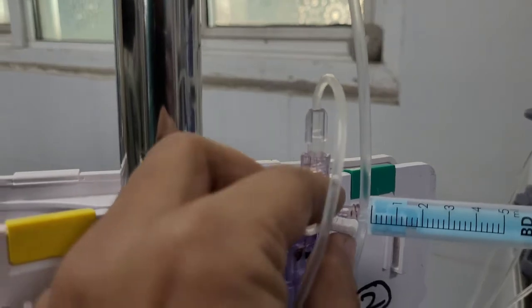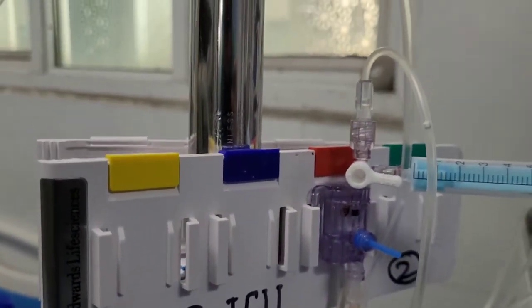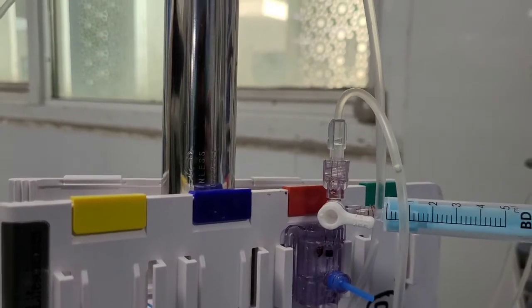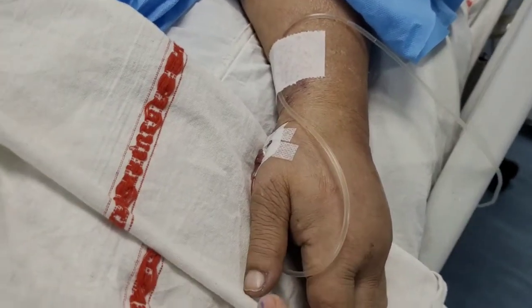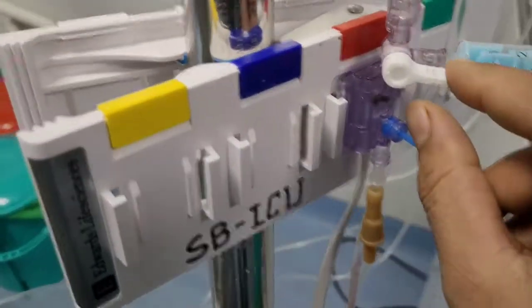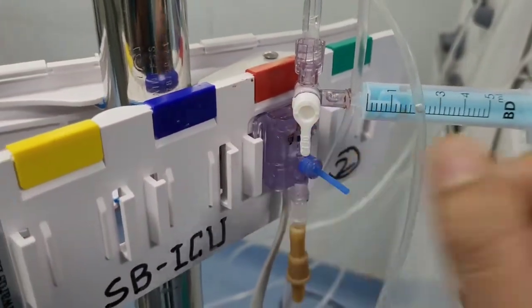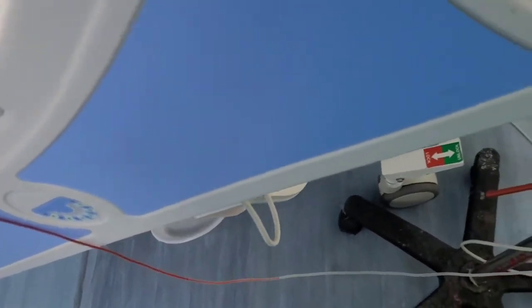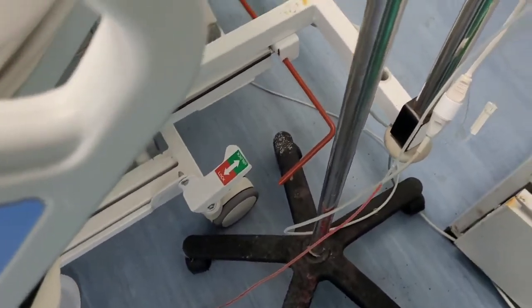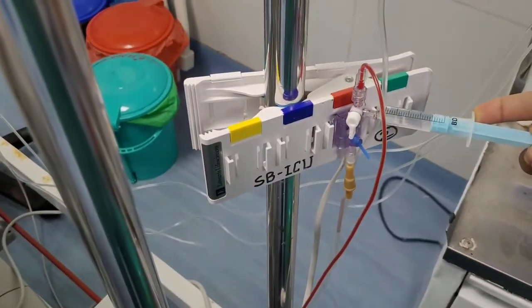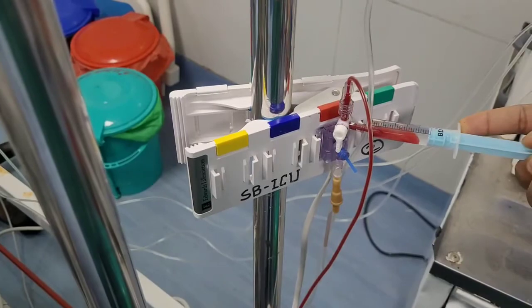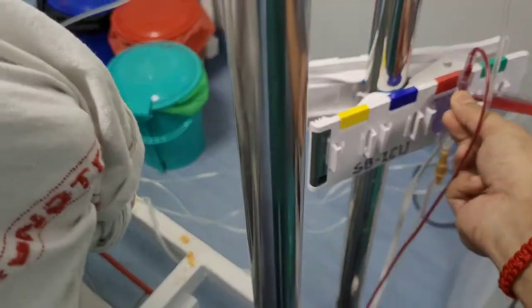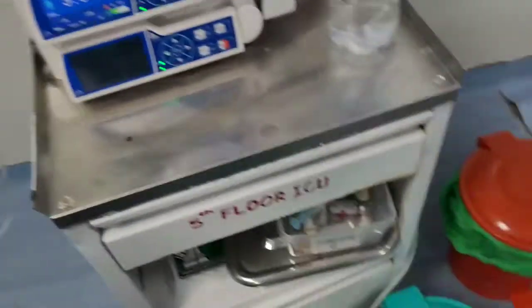Now I will show you how to zero this arterial line and show the BP. First we have to aspirate this blood, which might be clotted. We will aspirate by turning this off, and you will see blood will come. We will discard this blood.